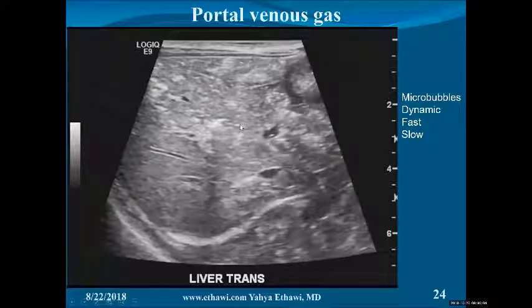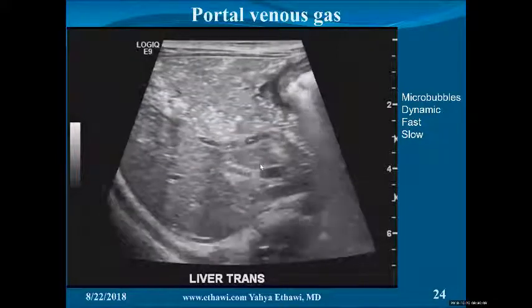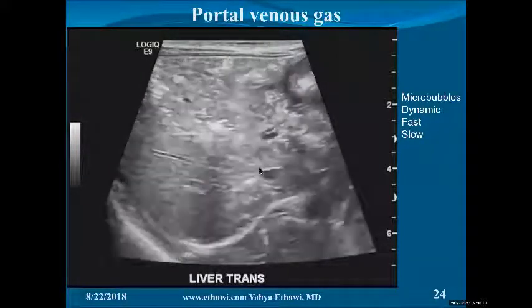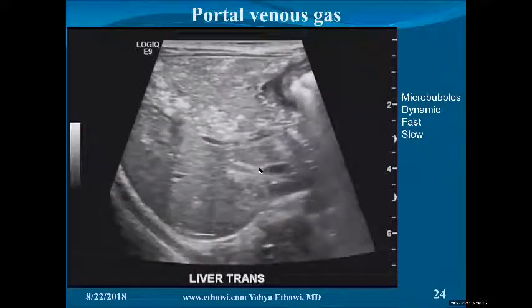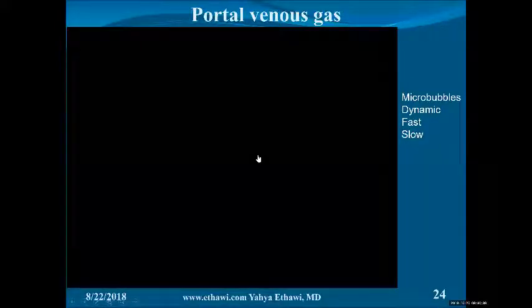Probably, yeah. But remember to use the lowest contrast. I mean, the lowest whitening of the picture. That's the most important. Less white, more dark. Lowest contrast means you turn it down before it becomes totally black, to avoid confusion between increasing echogenicity of normal structure and really whitening air.